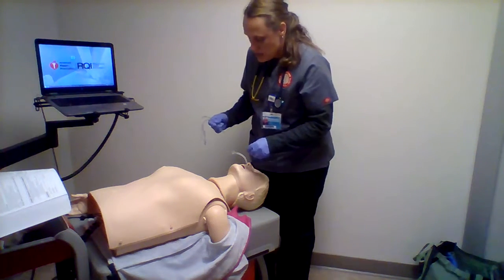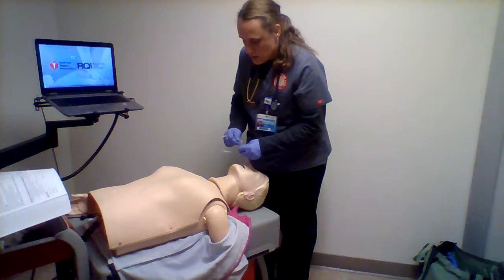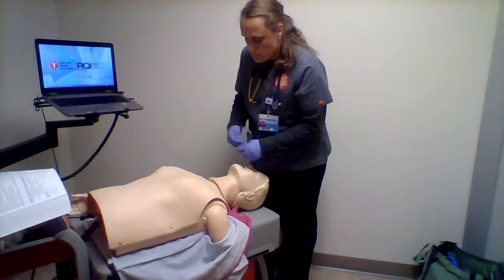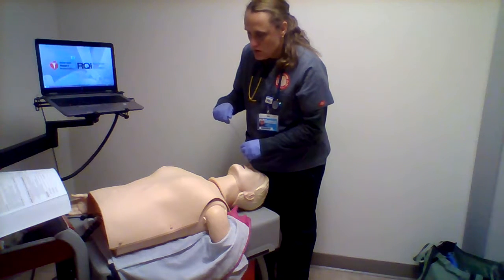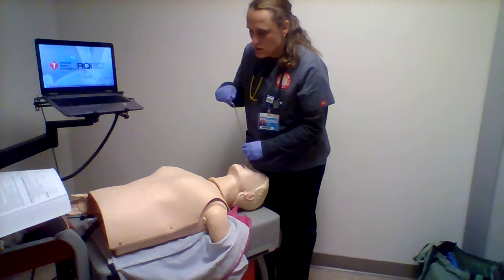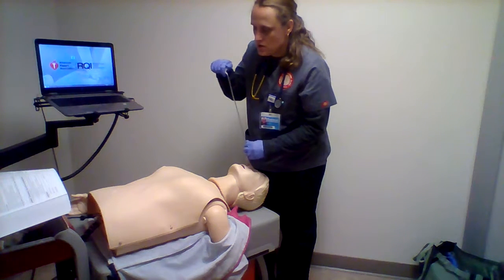Fantastic. It's going to be a little bit uncomfortable. So we're going to go down in here — it's probably going to cause a cough or gag, as people do — until I feel some resistance. Then I'll put my thumb over the port and pull out while twisting. It shouldn't take more than about 10 or 15 seconds to do this.